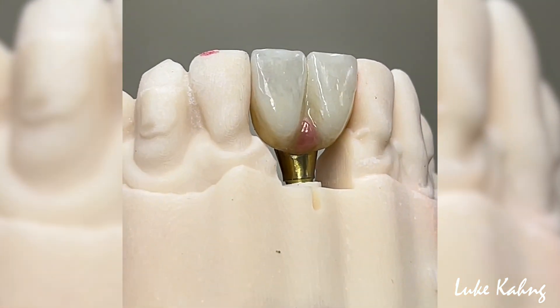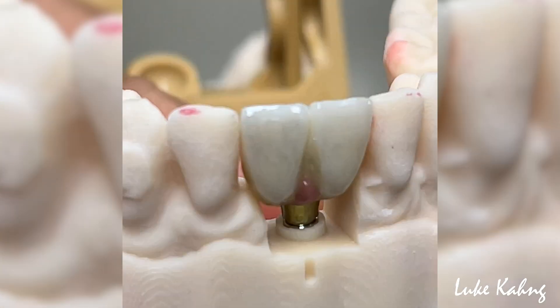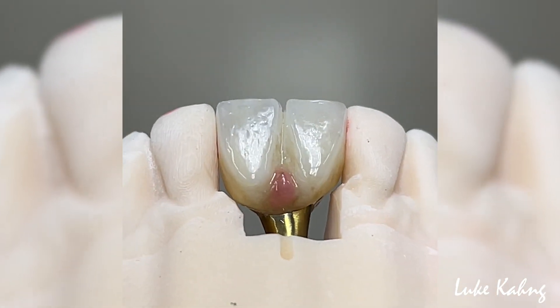Finally, the zirconia is cemented to the implant. This is after the implant itself has been anodized in gold.